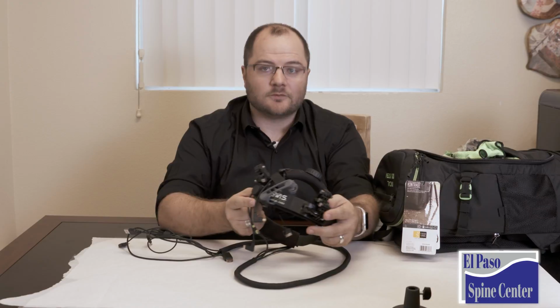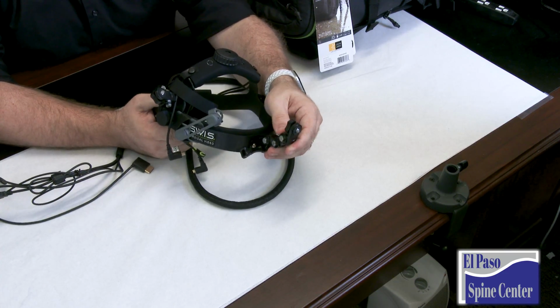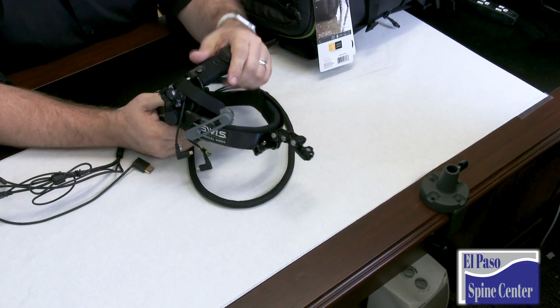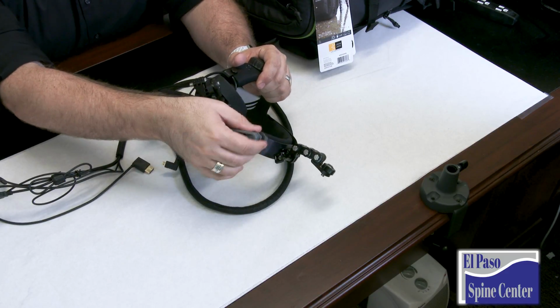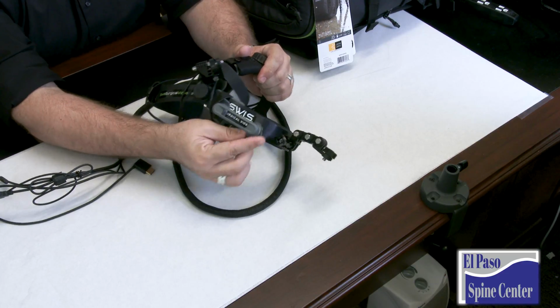But if we go over the different parts of the headgear, we're going to see that there is a GoPro mount on the front, highly articulated. It can be put at just about any angle from the front. There's also a gray connection piece right here. This does come off. I remember when I first got this, it was attached, and it took me a while to figure out that it actually pops out.